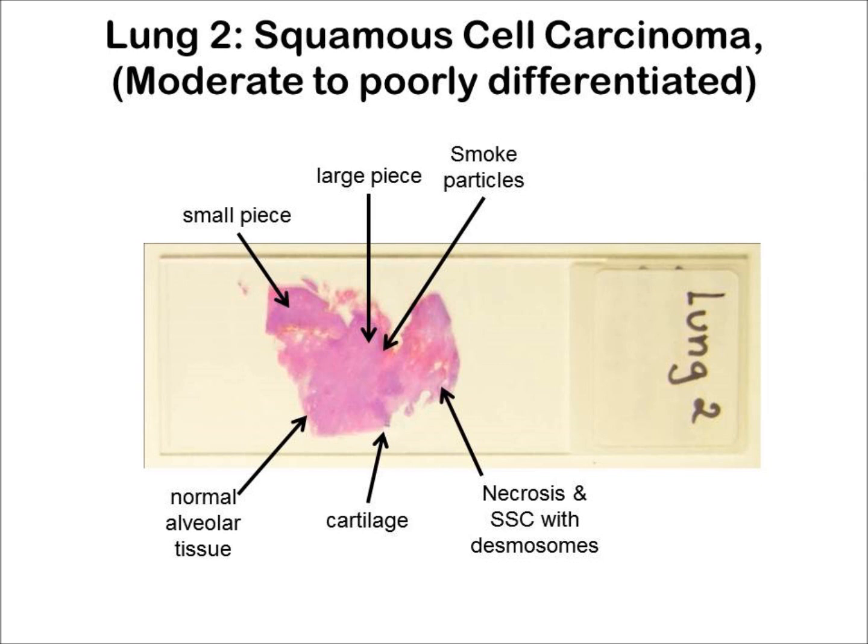The center of the larger fragment contains a single tumor mass, and adjacent to this are several smaller, independent masses surrounded by collagenous connective tissue. The location of two very small pieces of cartilage that stain a dark blue is indicated by one of the arrows.